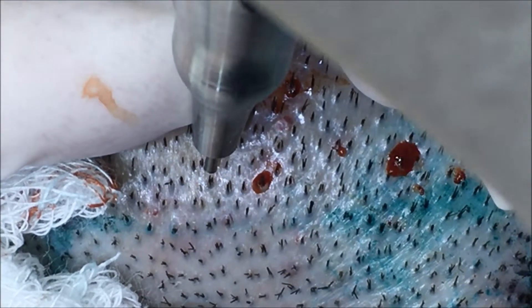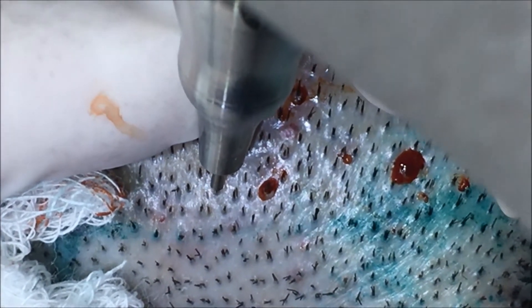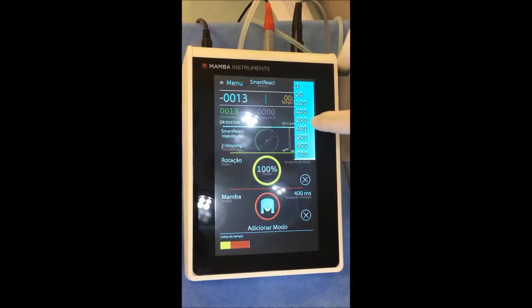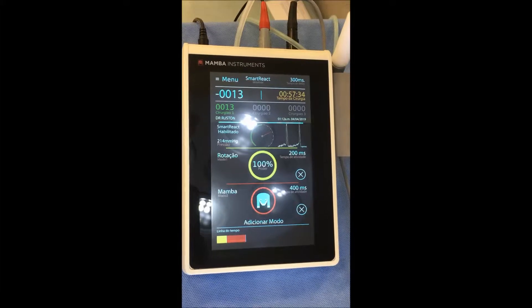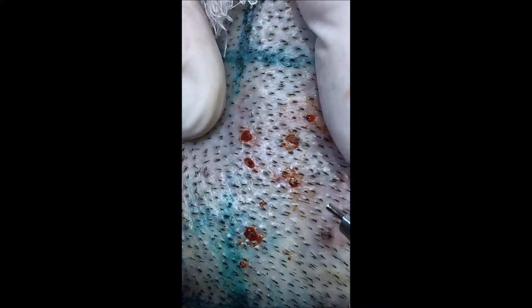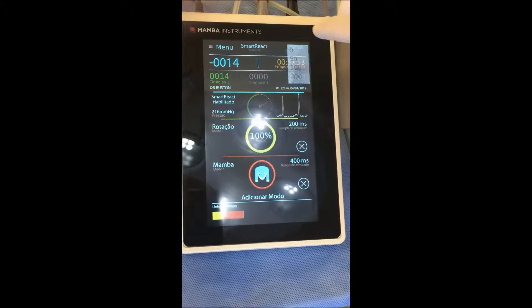You can increase the smart reaction time to have more or less time for engagement. Now I'm at 700 milliseconds, and now I'm going from 700 to 300 milliseconds, and now from 300 to 100 milliseconds.